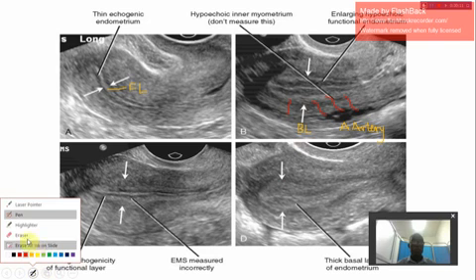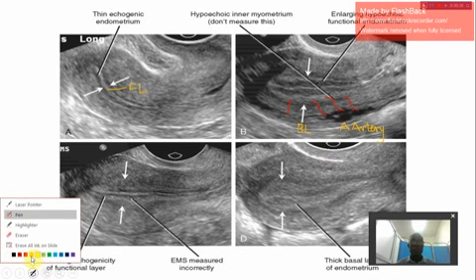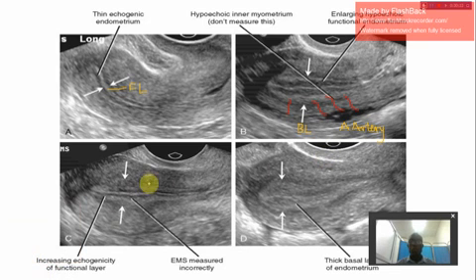So you can see that as easy as possible. We also have the endometrium measured incorrectly. We don't measure the endometrium like this. We measure from here, like that, from here to here. Here, at the endometrium, is how it is measured.